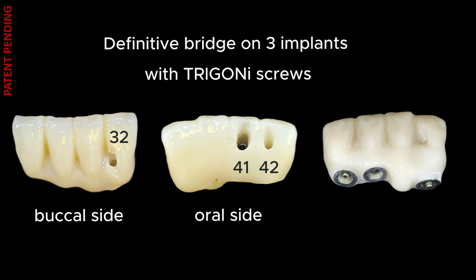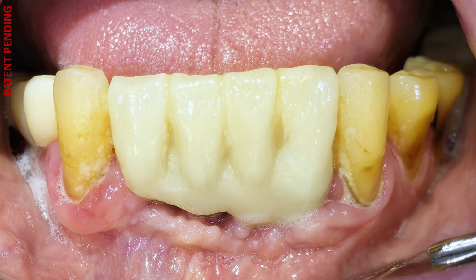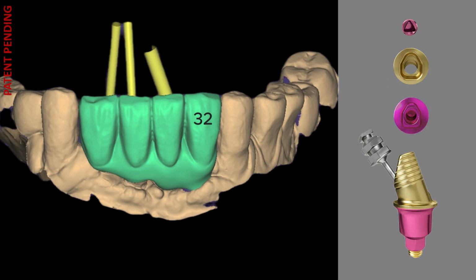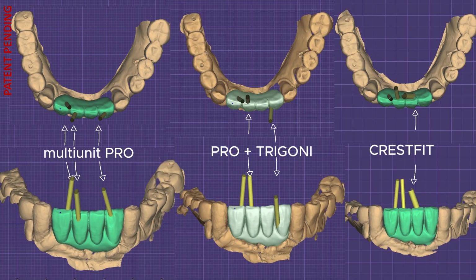The patient was satisfied, but he was unhappy with the excessively light shade of the teeth. I therefore took the opportunity to redo the work using the Crest Fit multi-unit, which allowed significant improvement in aesthetics. Here you can see how the positioning of the screw channels changed.